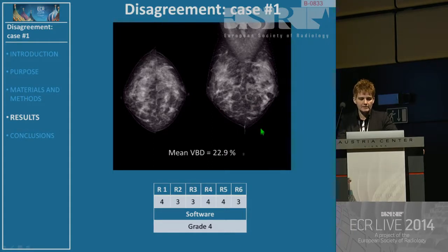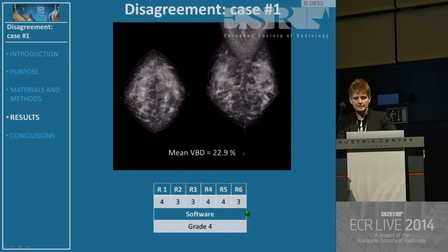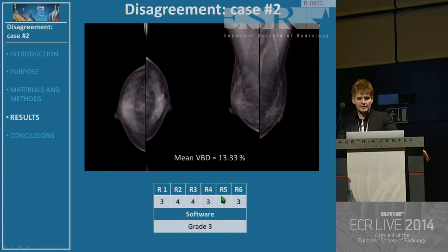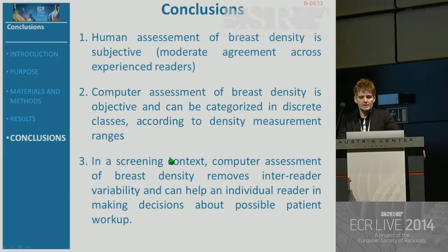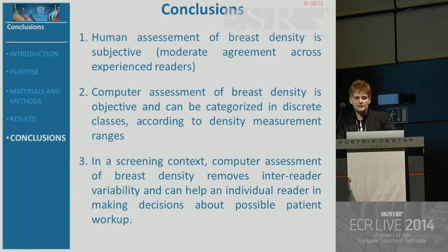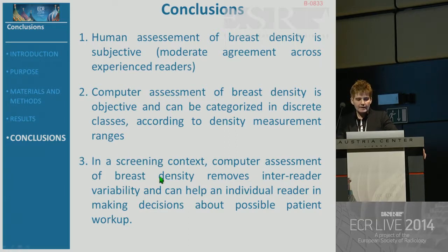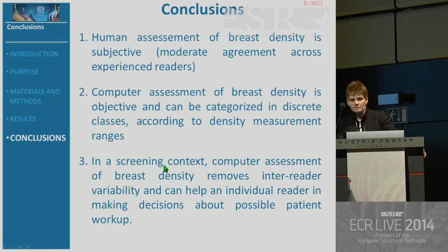Here are two examples of disagreement. The first case has a Volpara mean volumetric breast density of 22.9%, and half of readers classified it as BI-RADS three and half as BI-RADS four. In the other example, with a lower volumetric breast density, the radiologists again split half BI-RADS four and half BI-RADS three. The conclusion of this work is that human assessment of breast density is subjective with a degree of disagreement across readers, while computer assessment is objective and can be categorized and tuned according to the population. In a screening context, computer assessment could reduce inter-reader variability and help individual readers in making decisions about possible workup. Thank you for your attention.